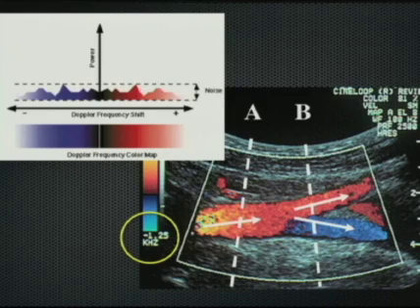Once we've determined the sign of the Doppler frequency shift, we then look at the value itself. And we can use a color map to show the relative Doppler frequency shift. Generally, less saturated colors indicate higher Doppler frequency shifts. Darker colors indicate lower Doppler frequency shifts. And as we'll see a little bit later, we can really assign any color to any Doppler frequency shift. And this, in fact, is a source of considerable potential confusion and error.